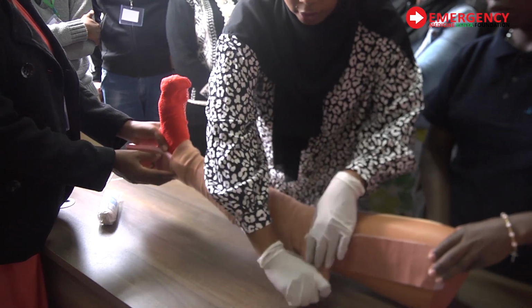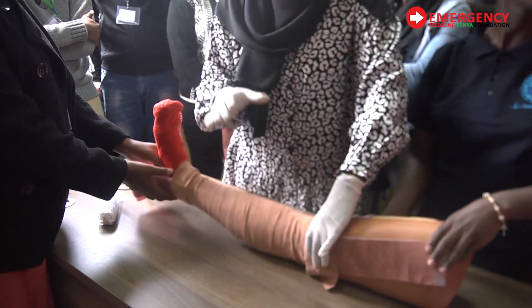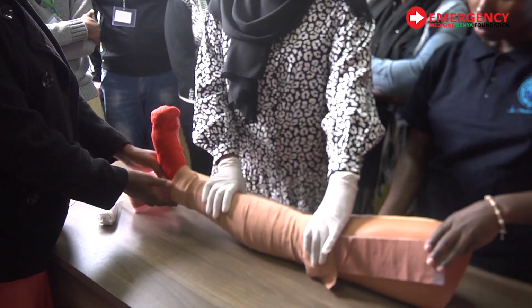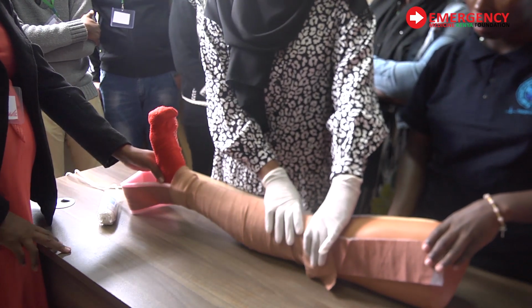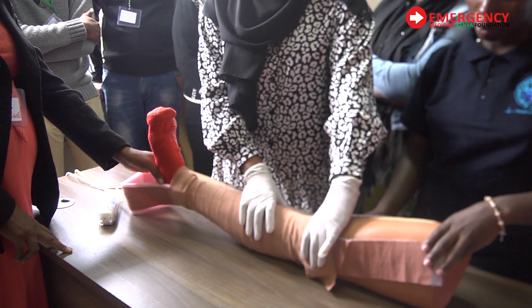And then you secure, okay? So you can use a tape. Can you assist me with the tape there? So you've done that, okay? So after you've secured, the next thing is to actually put the Thomas splint, okay?